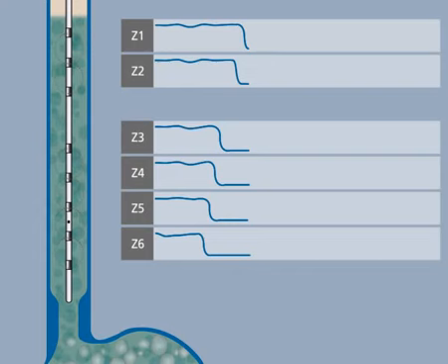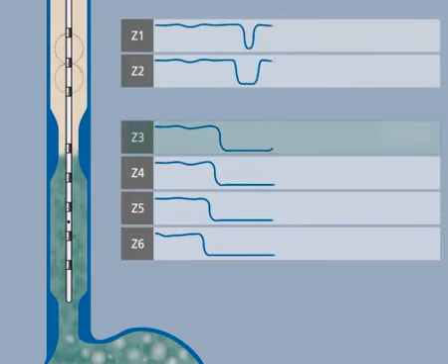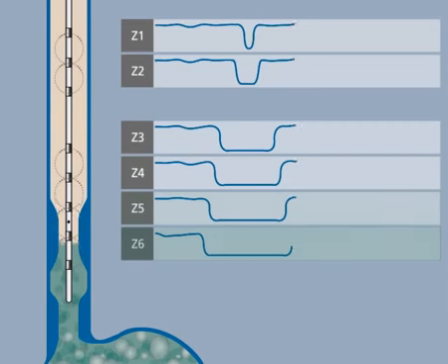This example shows the proximal extent up to the top impedance channel. On every channel, the impedance dropped, indicating refluxed bolus. The refluxed contents are removed from the esophagus by a peristaltic contraction. This is called clearance.